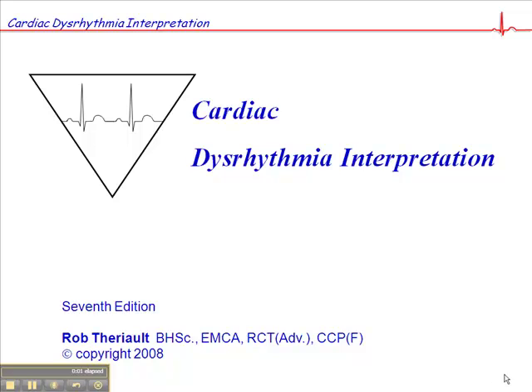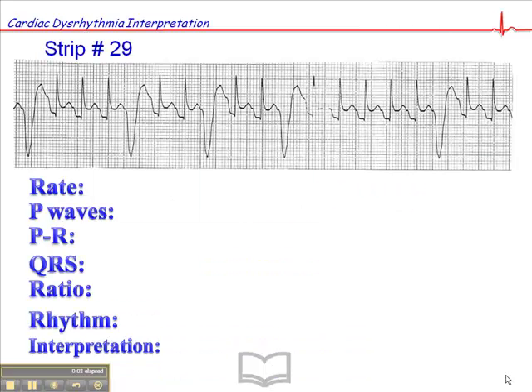Turning to page 99, exercise 29, here is a nasty-looking rhythm. We have what appears to be a pretty consistent underlying rhythm with these wide, complex, premature beats happening periodically, and the heart rate is about 200 beats per minute.